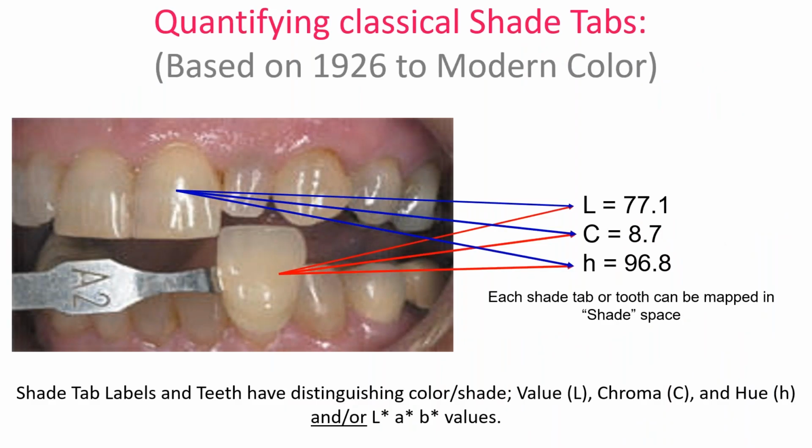And this is the same with laboratories who take custom shades as well. So this is not just for the dentist, it's also for us as lab technicians to make sure that we standardize and that we're getting the most out of the shade.